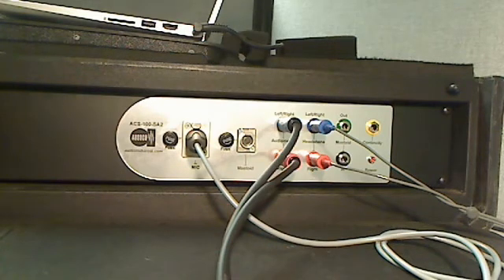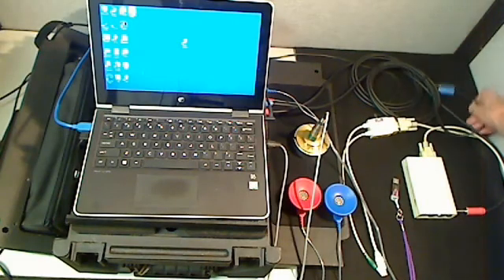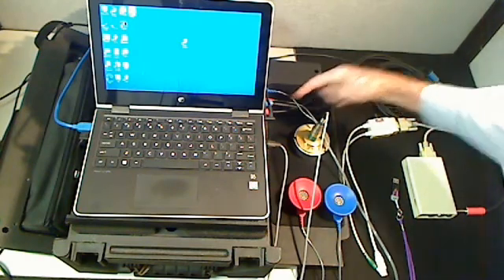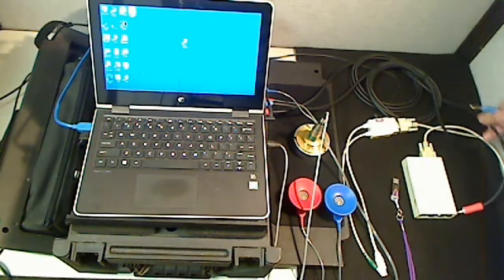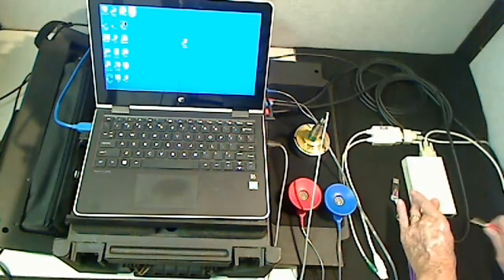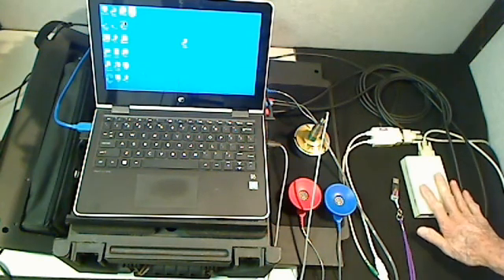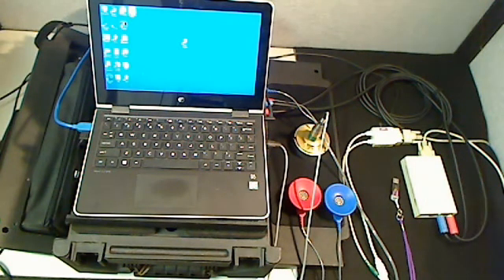We're going to take the patch cords, which are connected right here, and bring them around and connect them into the audiometer where we've just taken out the headphones. The reason we're doing that is because the ACS system also does an electrical analysis of the entire audiometer system. It not only does the acoustical portion, but the electrical analysis as well — which is a little difficult to do with just a sound level meter.